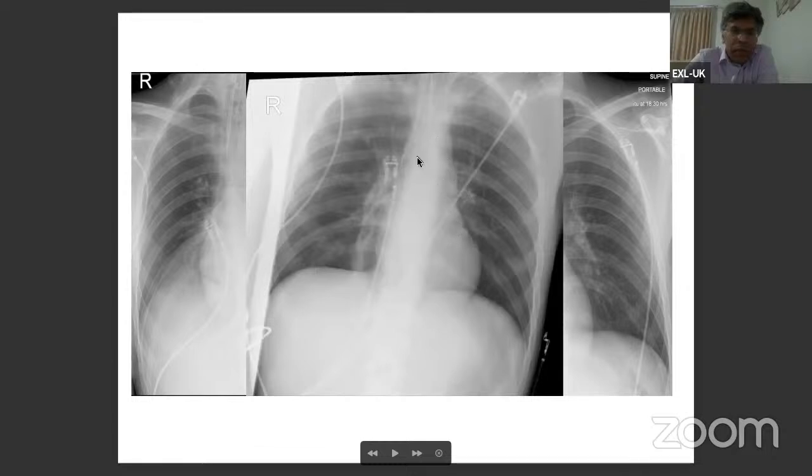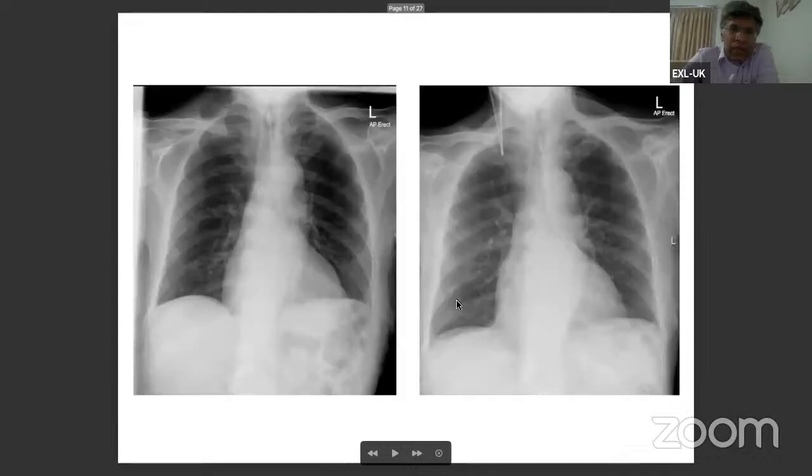The next one you can see, it took about 3 attempts. And actually the guidelines say that after 3 attempts, you've got to stop. So it's very, very important that you get it right. Okay. Now, moving on. Now we can think about that's one of the errors that can happen.